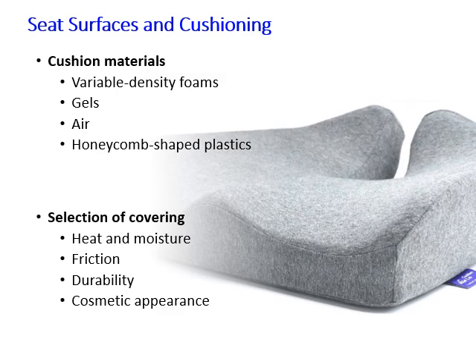The covering is also going to be important. You want to think about heat and moisture. If you're sitting all day long, you want to think of the buildup that occurs from the body up against the surface, the friction as well, how durable the material is, and of course it's got to be cosmetically appealing or at least acceptable to the user.